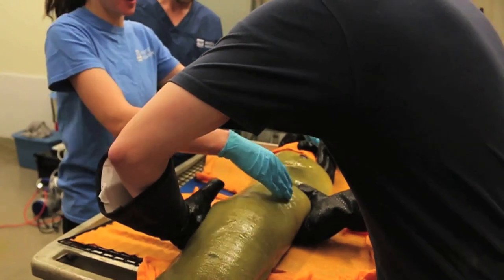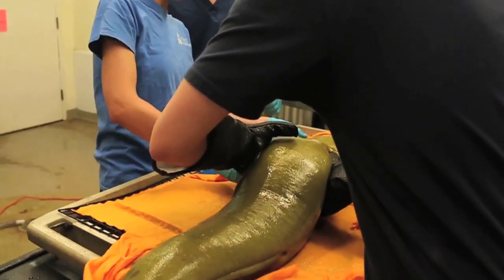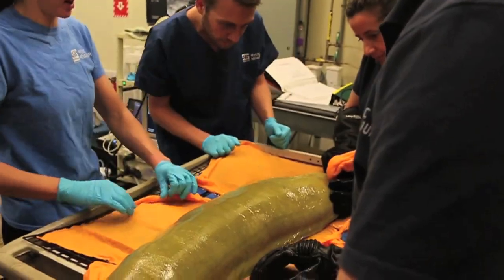The physical examination itself will start off with our veterinary team assessing the outward appearance of the animal, looking for any wounds, any scars, any lumps or bumps that may be there, and getting a good look at their eyes to make sure that they're clear.